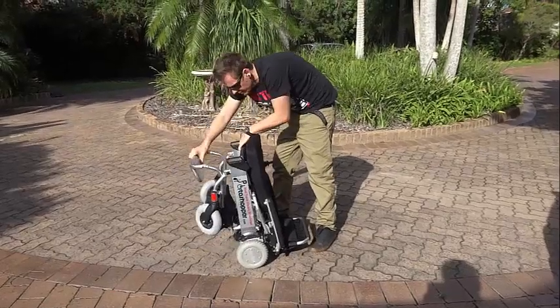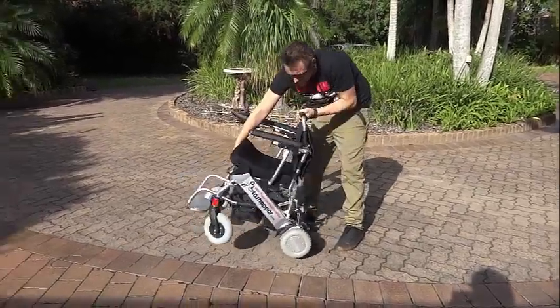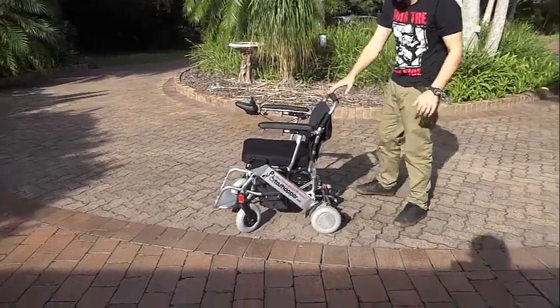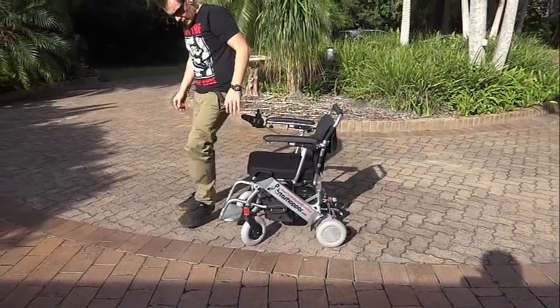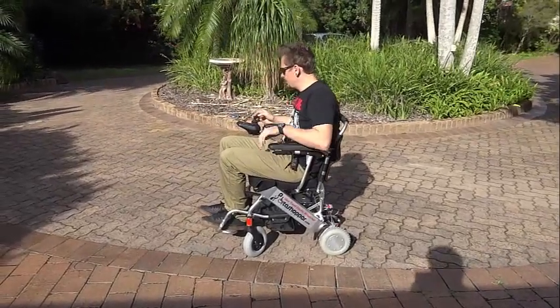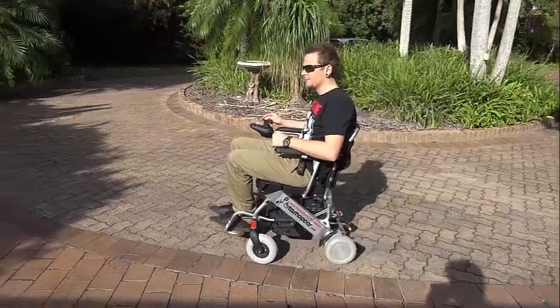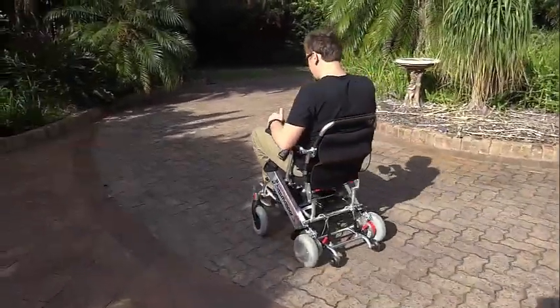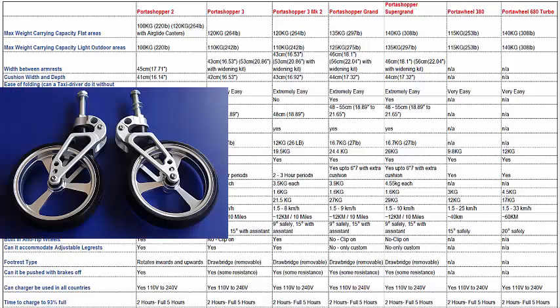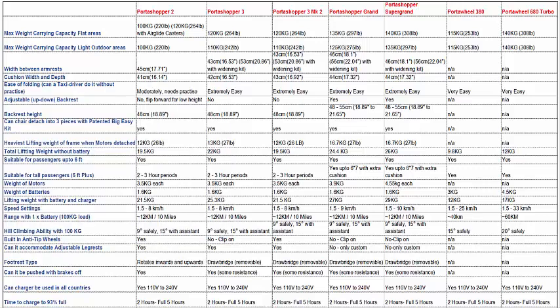There are two things to point out. The first is that it ships with pneumatic rubber front casters that generate high friction, which impairs manoeuvrability on high friction surfaces such as carpets. You can overcome this by inflating the front casters to around 50 psi, but for excellent manoeuvrability and a very smooth ride, I would recommend the air glide suspension casters, which reduces friction and allows you to spin on a dime despite the surface.